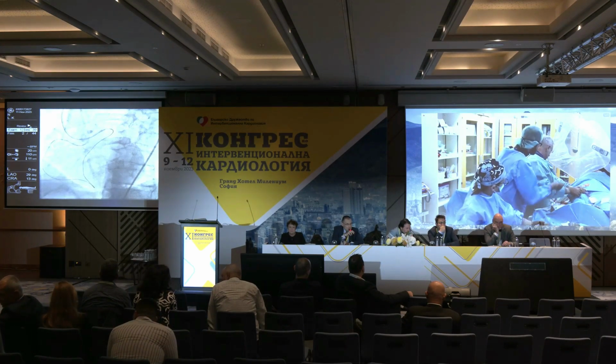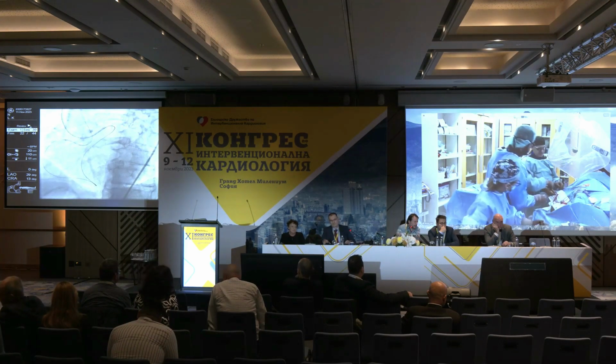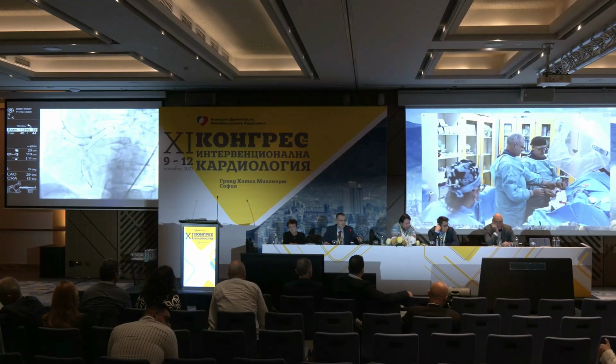Okay, George, we are back to you. Okay, focus on the hands of Dr. Gelef if we can, a little bit as a background.